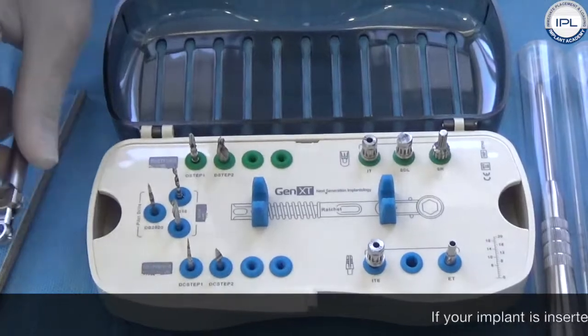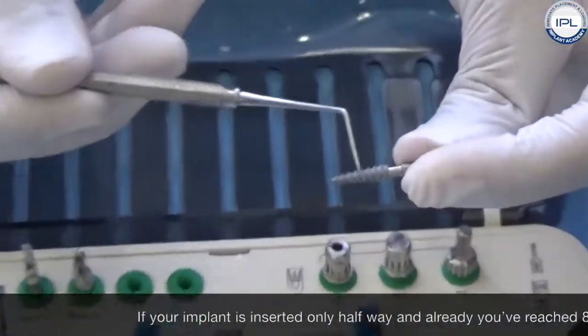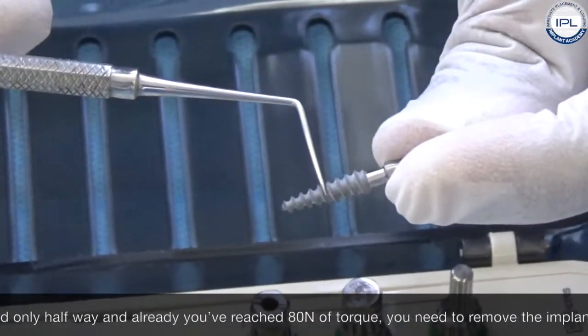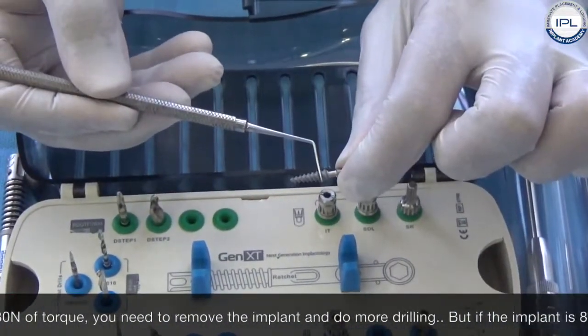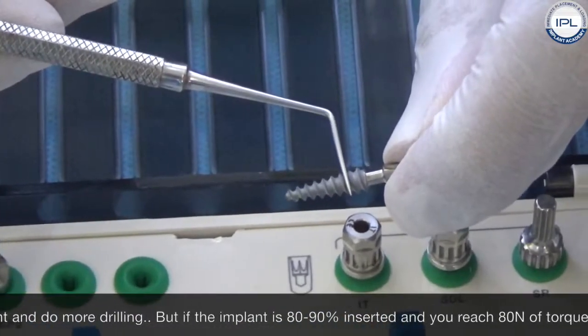If your implant is inserted only halfway into the bone and you have already reached 80 Newtons of torque, you need to remove this implant and do more drilling. But if your implant is 80 to 90 percent inserted and you reach 80 Newtons of torque, it is manageable.